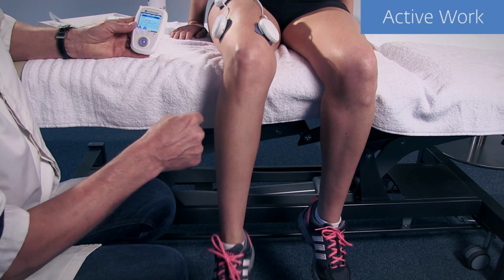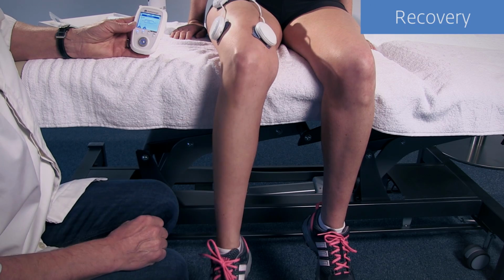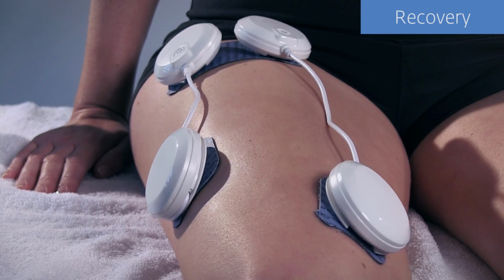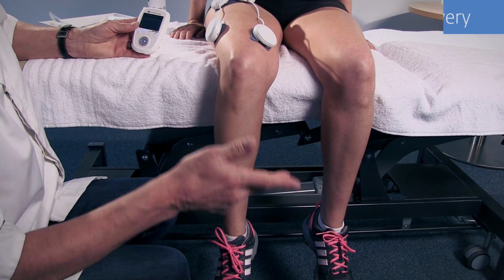Active work can be done using open chain or closed exercises, and programs comprise varying lengths of work and recovery depending on the one selected.